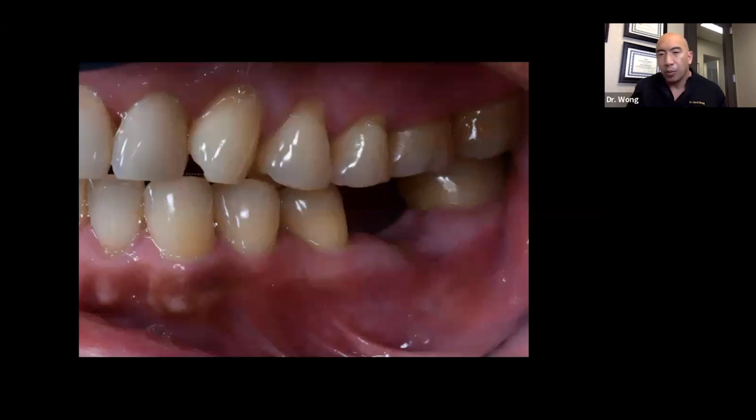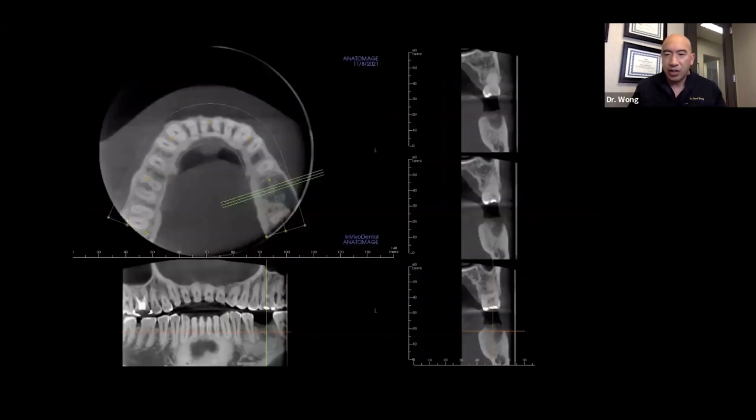So what's the problem? The problem is when you take a CBCT, you can see there where that root used to be. It has not filled in with bone. So try putting in your implant perfectly and getting good stability. I mean, it can be done, don't get me wrong, but clearly that patient is still going to need additional bone graft placed, that we still need to have a membrane and some soft tissue management there.